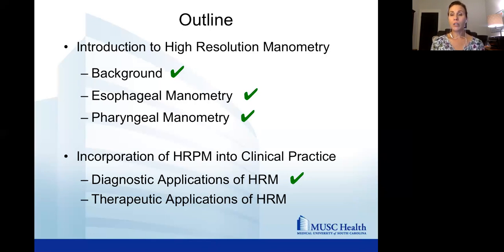If it was a patient that I wanted to know more about their esophageal function, then it would be somebody that I might get an esophageal study on. I don't have a one-size-fits-all. It's not like everybody that comes in gets a manometry if they're going to have XYZ. It's patient by patient. I probably do lean a little bit more towards wanting to know what the esophageal function is, although the vast majority of esophageal function studies that we do are geared towards looking at people who are surgical candidates for lower esophageal sphincter augmentation or Nissen fundoplication, etc. I hope that answers that.